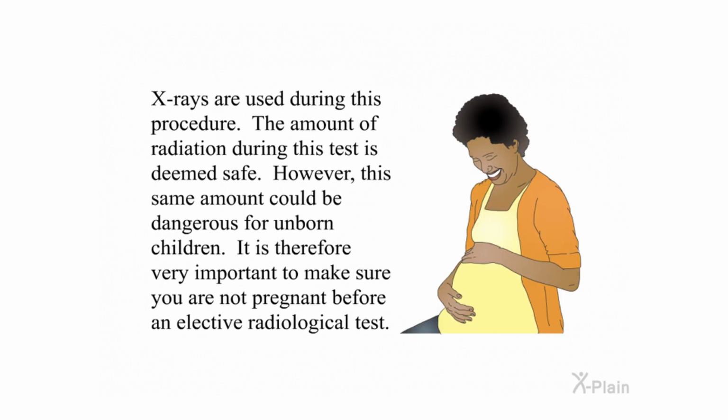X-rays are used during this procedure. The amount of radiation during this test is deemed safe. However, the same amount could be dangerous for unborn children. It is therefore very important to make sure you are not pregnant before an elective radiological test.